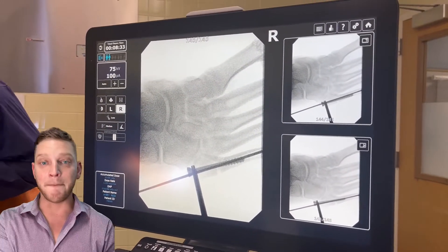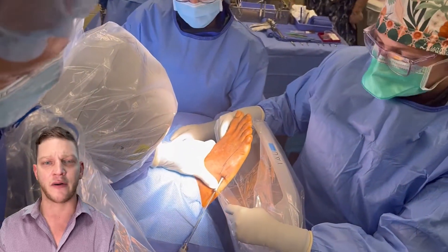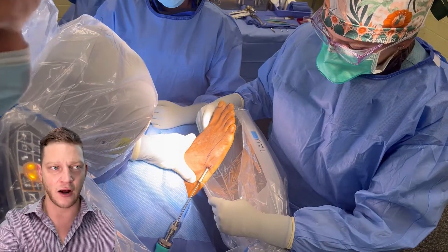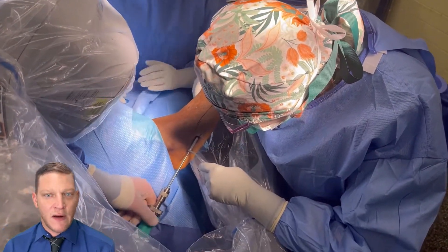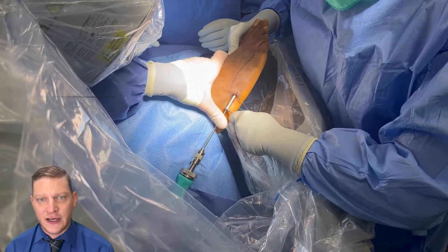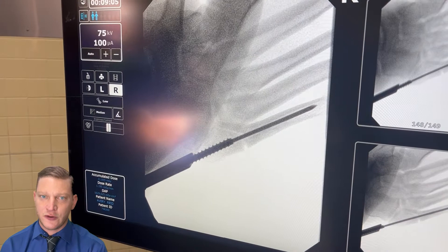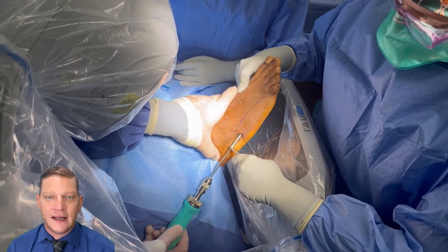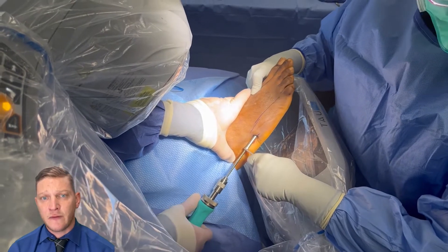Here we're measuring the screw to see if it's the right size. We use the fluoroscope to help. You can measure off the K-wire, but we don't want the screw going too deep — we don't need it that deep. We're using the bevel to make sure it's not going to be pinged on the joint. It looks like a good size. I got pretty close on one view but you always have to check the other view too. On the AP it looks dead center — great. Then I checked the lateral and I was off, so it became a sweat fest.